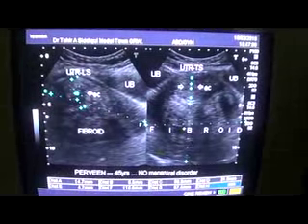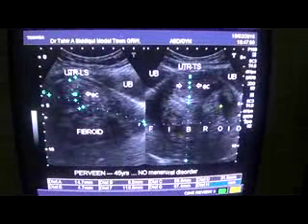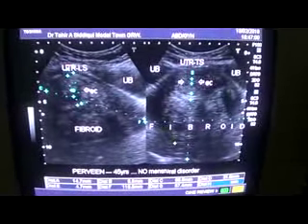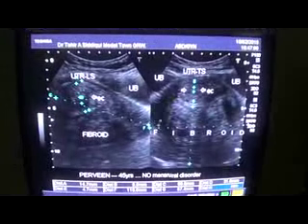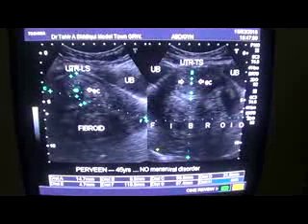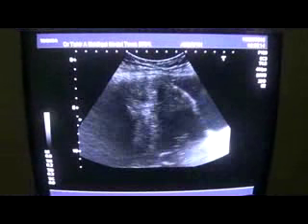So, now note the appearance. It is inhomogeneous, having solid element as well as a few cystic areas. These are a few cystic areas which are suggestive of internal necrosis or degeneration, along with a few calcified areas giving sharp shadow posteriorly. So this is a case of posterior uterine wall fibroid elevating the uterus anteriorly towards the urinary bladder.